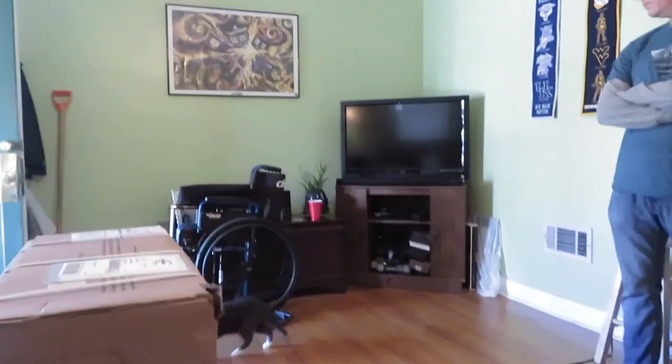The wheelchair I have is sitting right over there — the cat just walked in front of it — and it is just falling apart. I've had it for four and a half years and there's just no fixing the parts that are broken. So we needed to get a new one.